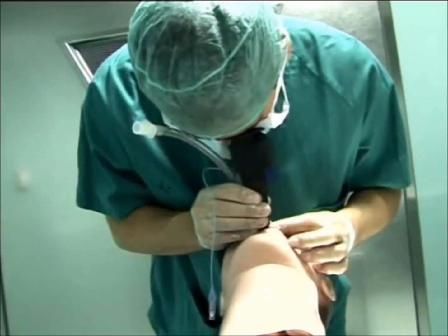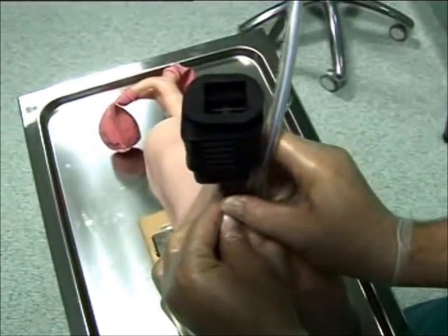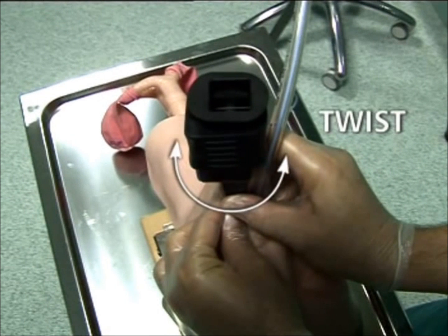Once in front of the glottis, align the vocal cords in the centre of the view by twisting clockwise or counter-clockwise.